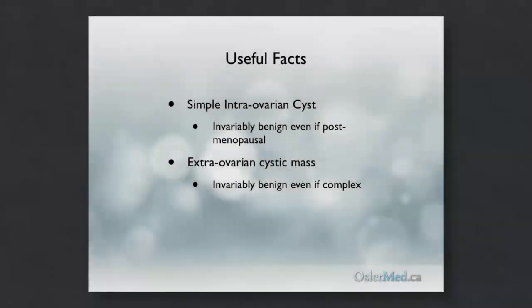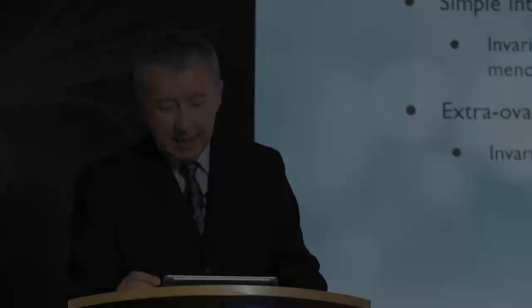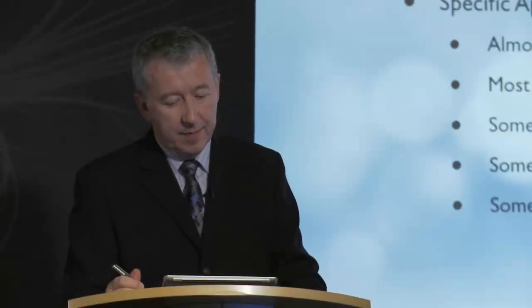Other useful facts: a simple intraovarian cyst is invariably benign, even if the patient is postmenopausal, whereas an extraovarian cystic mass is invariably benign, even if it's complex.